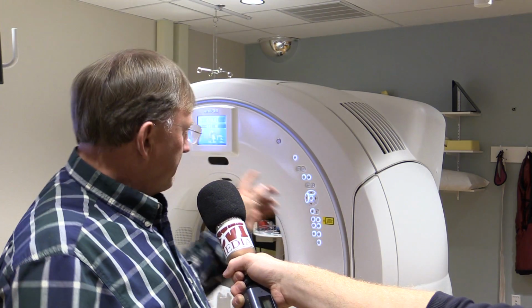Now these images are less than a millimeter thick in some cases. We can see high detail, and for example, if a person is in a bad car wreck and they have multiple injuries, we can scan their head and their neck and their chest and their abdomen, their pelvis in less than a minute or so, and get hundreds and hundreds of pictures in a very short time. Each time this scanner makes one circle around the patient, it's taking 128 different slice pictures. Previously, every time it went around the patient one time, it only took 16 pictures. So 128 versus 16, much faster, and the resolution is 3 or 4 times higher than the old scanner.